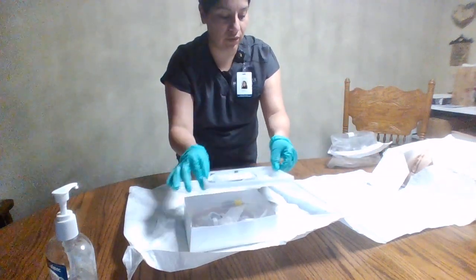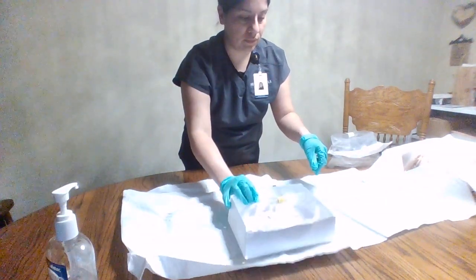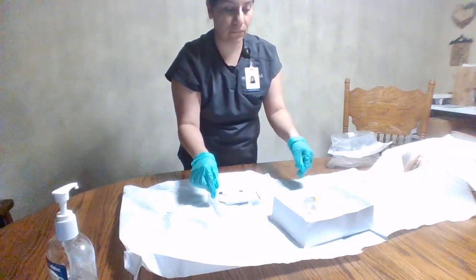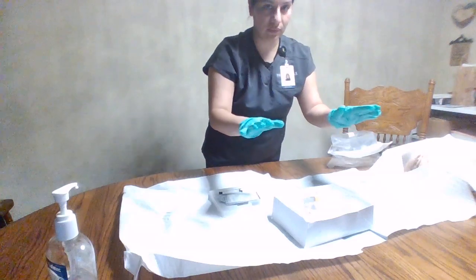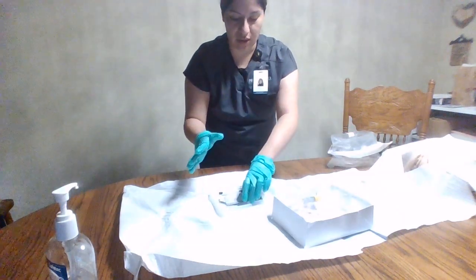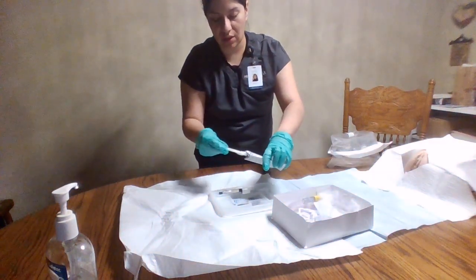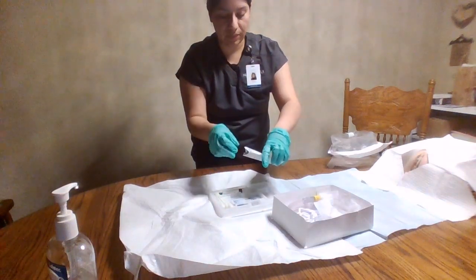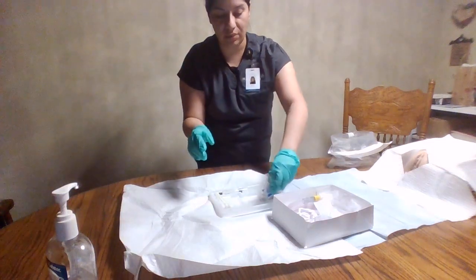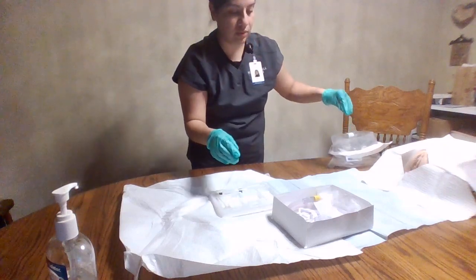And I'm just going to go ahead and get the Foley catheter kit set up here. Okay. So I do have the kit set up. I'm just going to go ahead and empty out the alcohol swabs. I'm going to go ahead and take those out and dispose of packaging. And I do have a lubricant here. We will go ahead and place that in the well here and dispose.